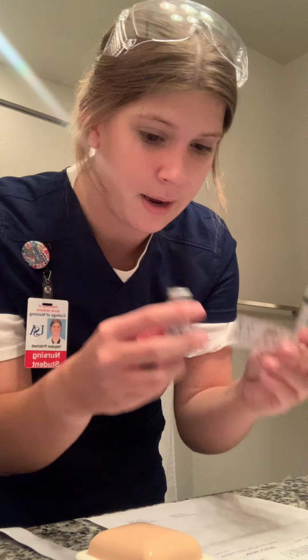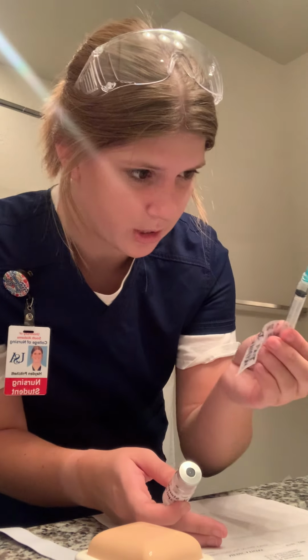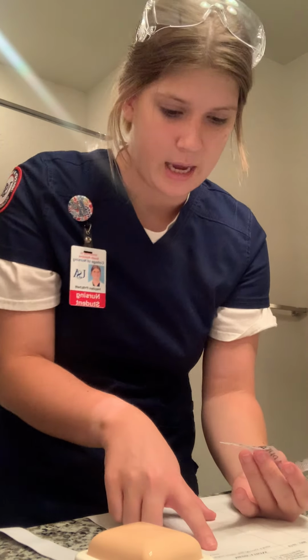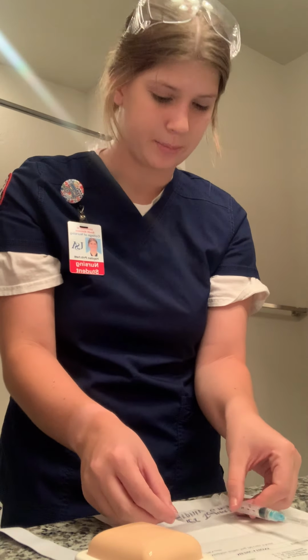So I have my morphine sulfate, and I have my syringe labeled with morphine. So that is correct. And then I have my 5 milligrams, which equals out to 1/2 milliliter. I have my intramuscular syringe. It's given every 4 hours, it's the time, and it's for pain, and my patient is complaining of pain. So I know it is time to give him his shot.